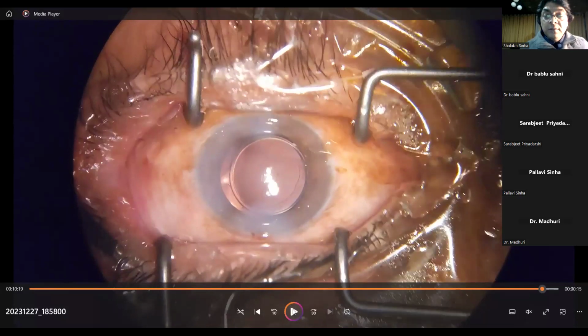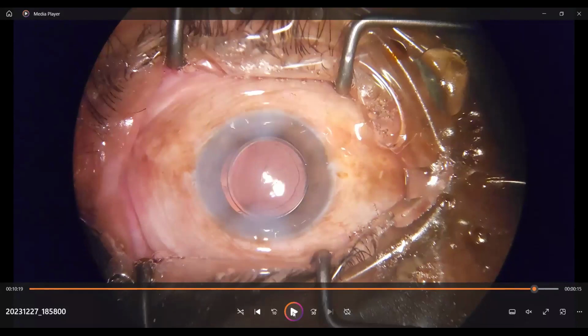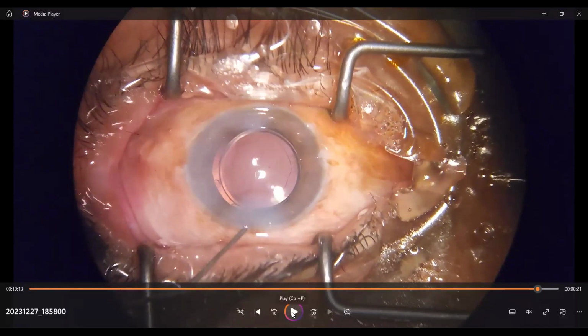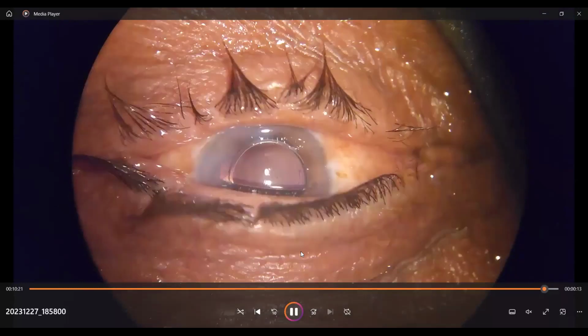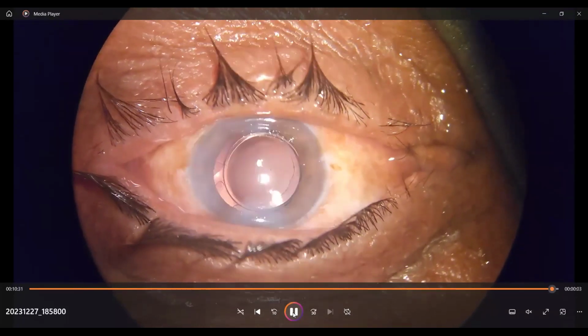So what you just saw was just before I injected. Let me just show it again. Here, I have loosened up the speculum just before I have injected intracameral moxifloxacin. Why have I done this? If the pressure is on the higher side, whatever moxifloxacin that you inject will tend to come out. So you just make the speculum slightly loose so that the globe is not very tight, and it will allow the moxifloxacin to stay within the eye. Again, you check, and then you come out. Normally, I use an antibiotic ointment that is placed in the cul-de-sac.